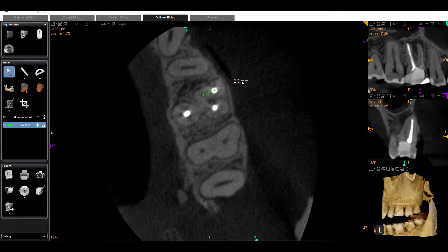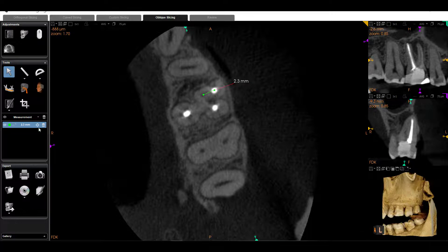In this specific case, the MB2 orifice might be easier to find and to visualize clinically. But for calcified cases, keep in mind to use your CBCT not just for diagnosis, but to also aid in your treatment planning.